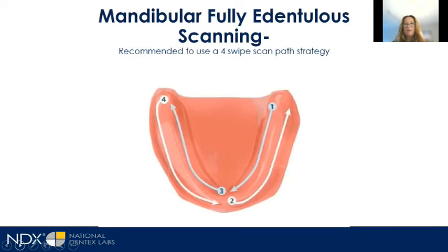Sometimes it is hard to scan in the mouth, and you may want to scan an existing denture, and you can do that. You can also do a wash on an existing denture, and you can scan that also.